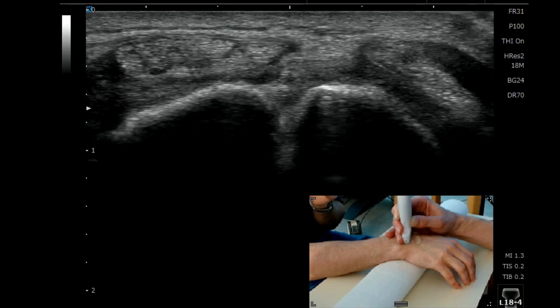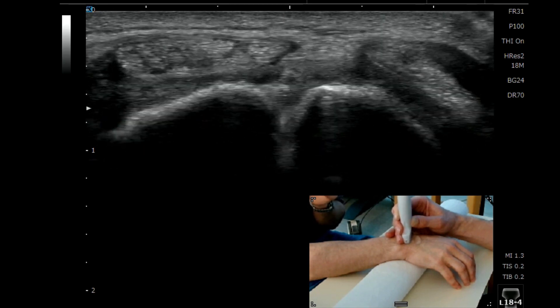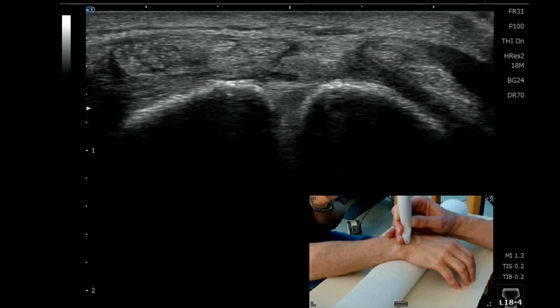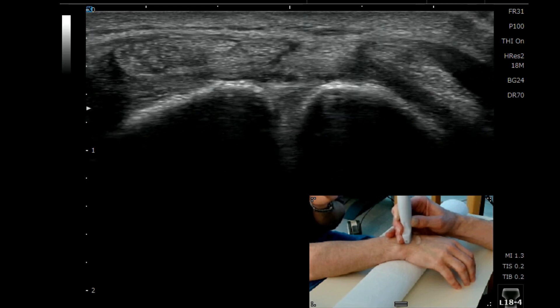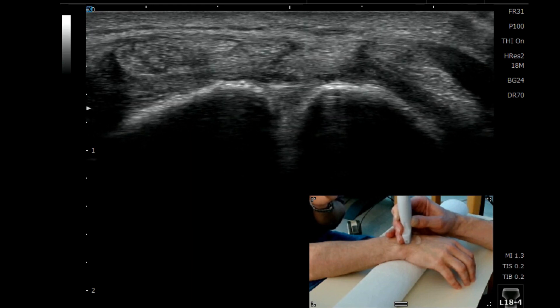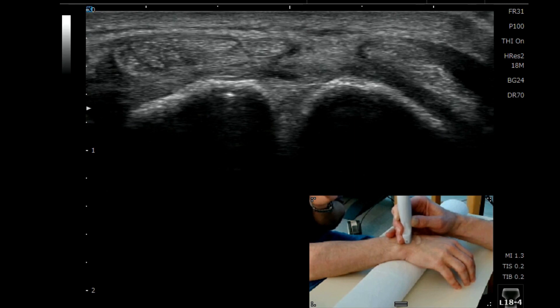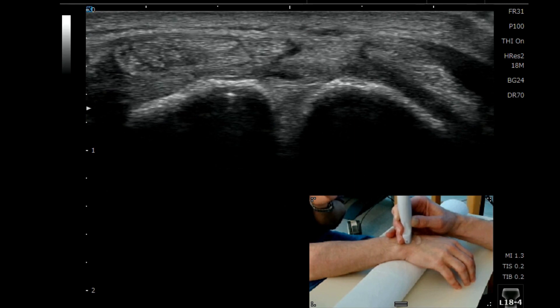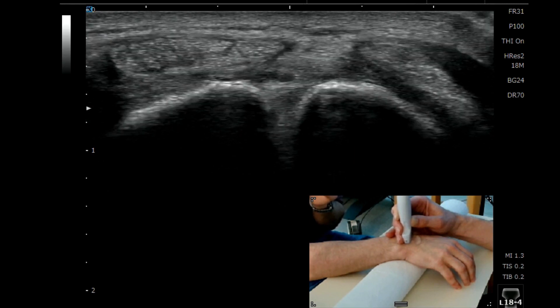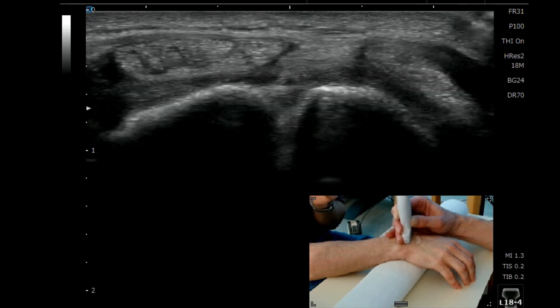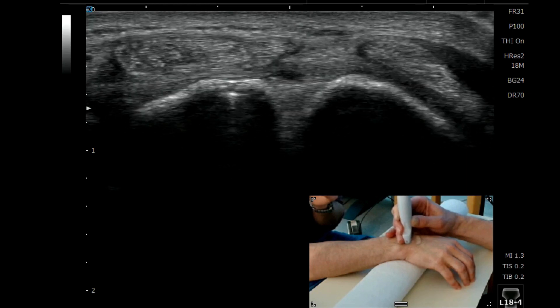There are different components to this ligament. Ultrasound can only show you really the dorsal fibres, so it's not a total way of viewing this ligament as it's complex, but it does give you a good idea.